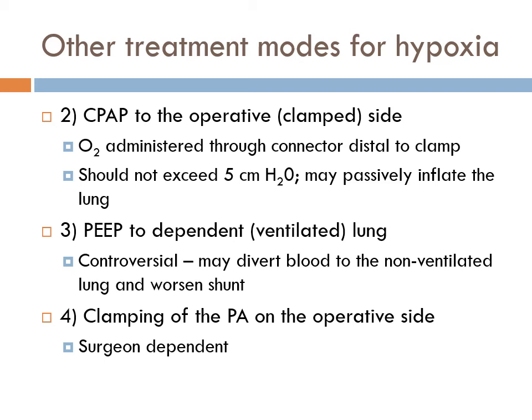You would still probably leave this open, you probably wouldn't close this because then it would override its pressure through the APL valve, and you tell the surgeon you're adding a little bit of CPAP. That's one possible way to fix this situation.